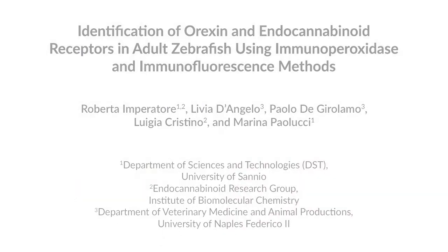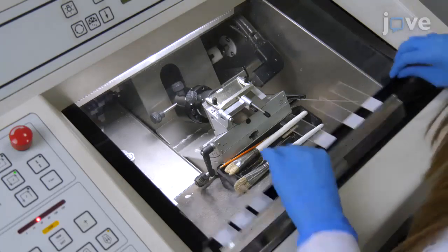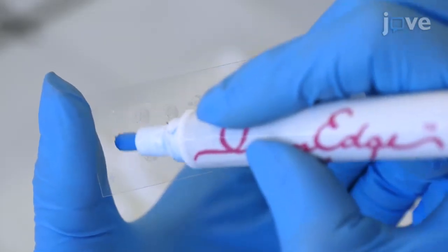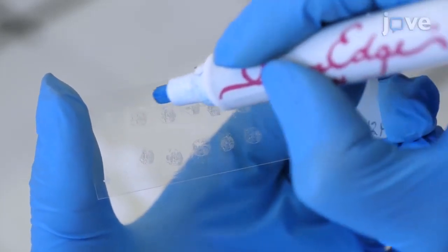Currently, immunohistochemistry is used with increasing frequency to identify the presence of specific molecular markers and their changes in case of pathologies, giving also the possibility to perform quantitative analysis. Immunohistochemistry, mainly the immunofluorescence technique, is used in the larval and adult zebrafish animal model, but little is known about a good standard immunohistochemistry protocol for zebrafish.